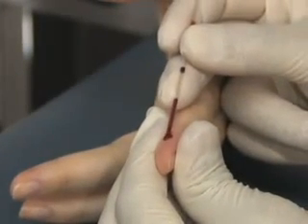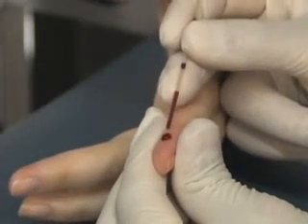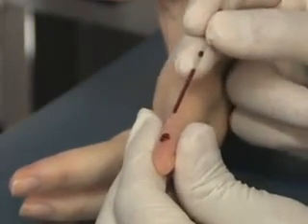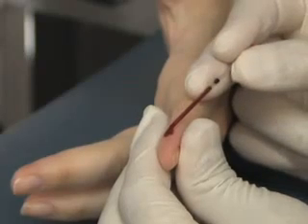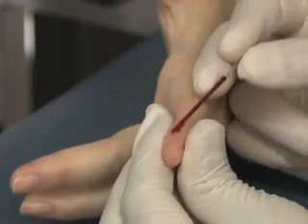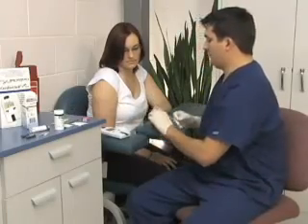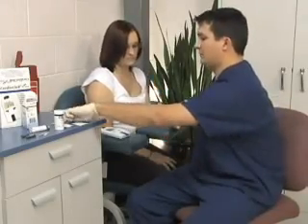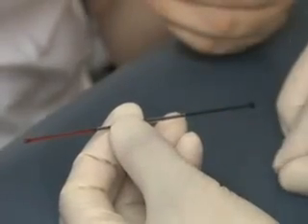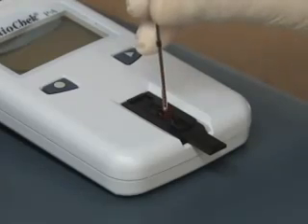Gently squeeze the tip to produce more blood. Make sure it reaches the black fill line and there are no gaps or air bubbles in the specimen. Once you've collected the specimen, tend to the patient, insert the black plunger into the end of the capillary device, hold it over the test strip, and gently press down to apply the sample.